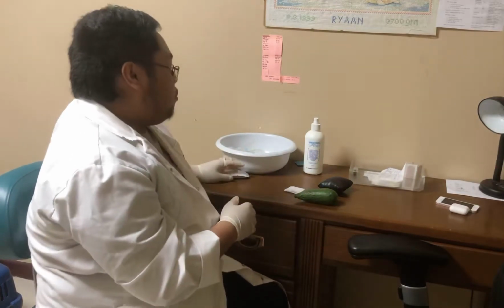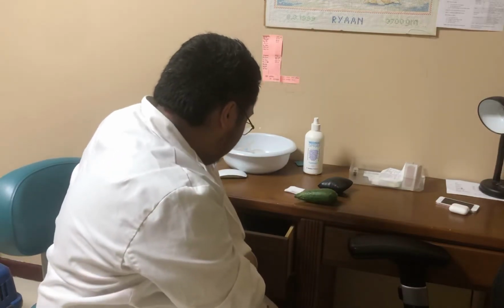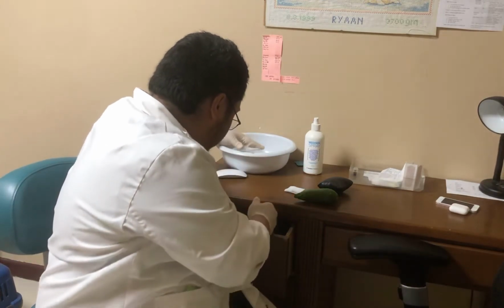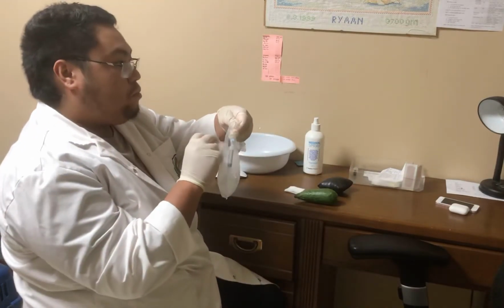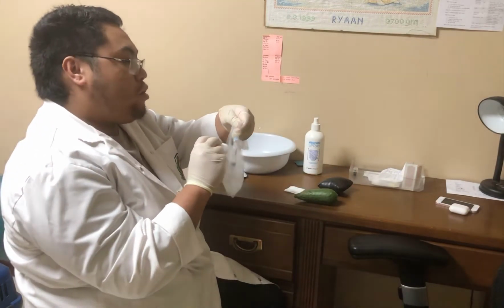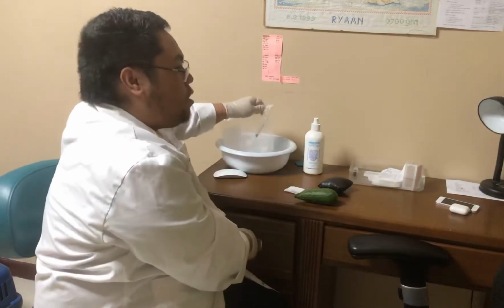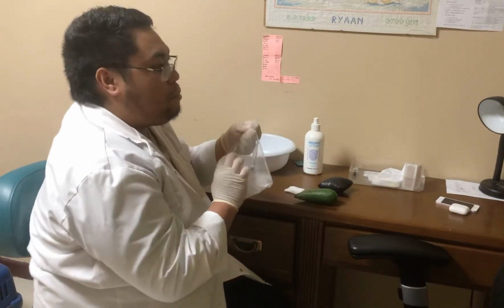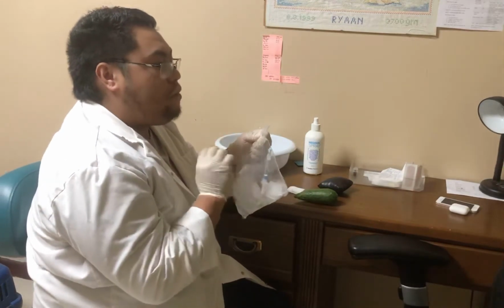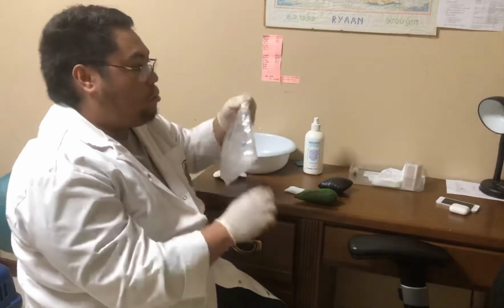After this, we need to label the specimen with the patient's data. Specific information related to the sample collection enhances the accuracy of the analysis of results. Note the percentage of the O2 therapy, if applicable, the temperature, especially if elevated, and the time the specimen was drawn. You need that information to be written.